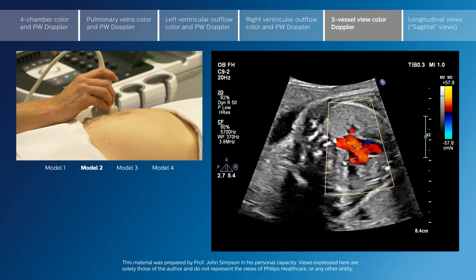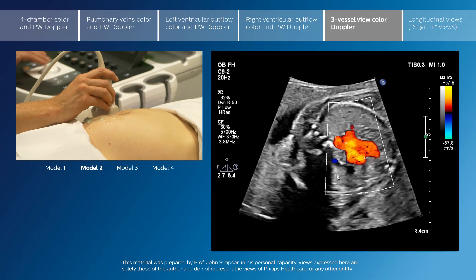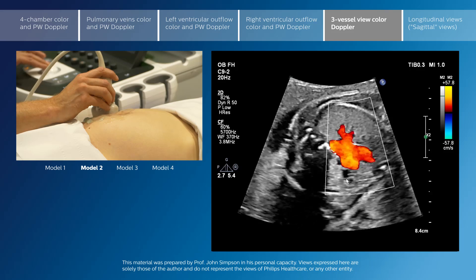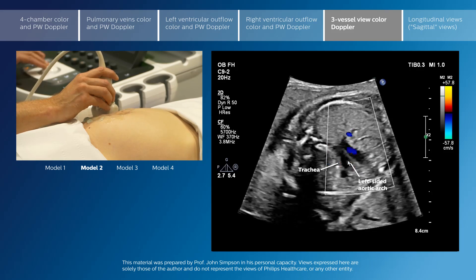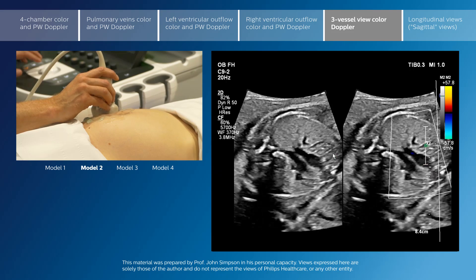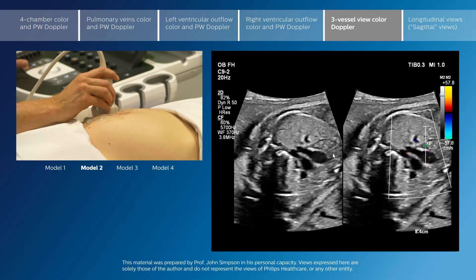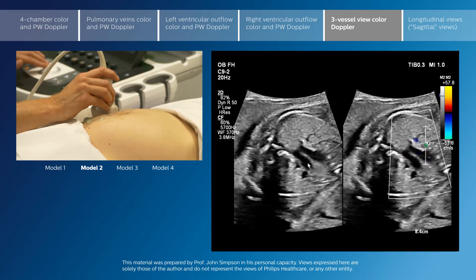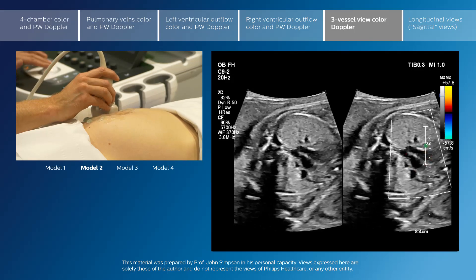We do not see flow so well in the SVC because it is seen in transverse section and is therefore coming through the ultrasound plane. But we do see this vessel on color flow, and if I show you this with the color compare modality, we can see both the cross-sectional view and the color view of the same vessels.